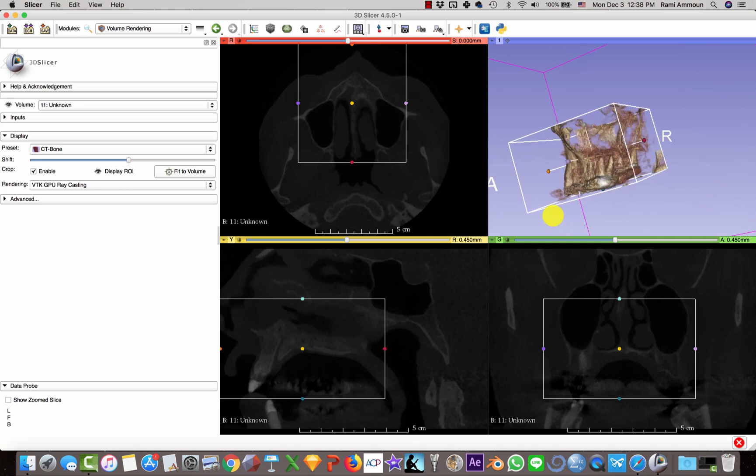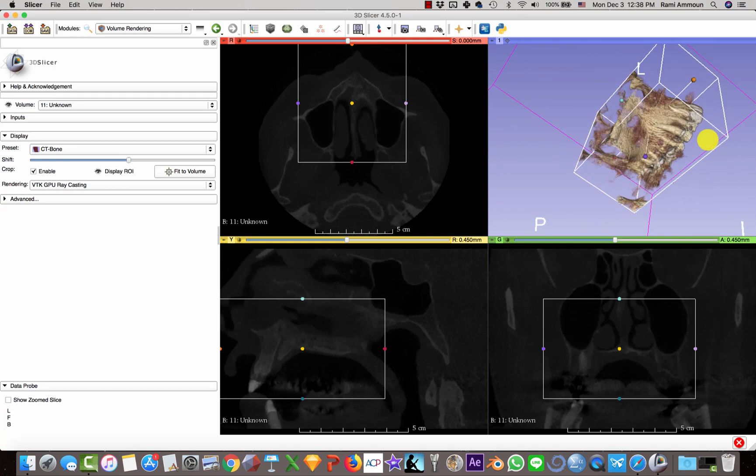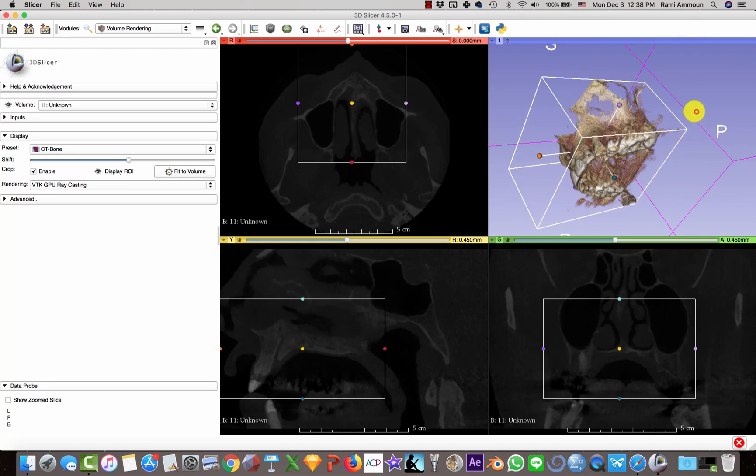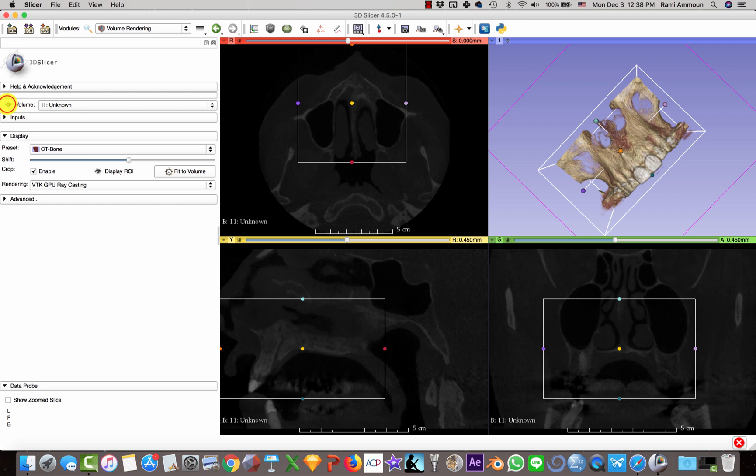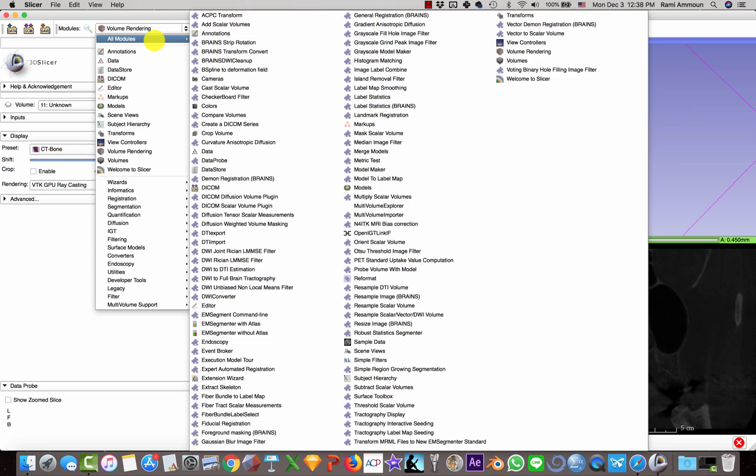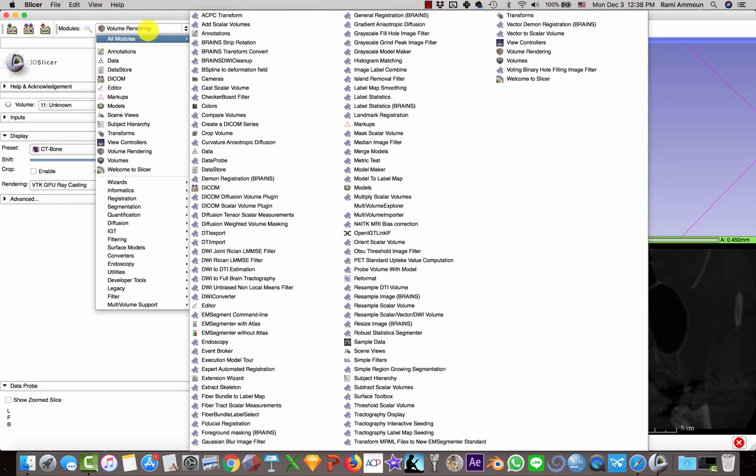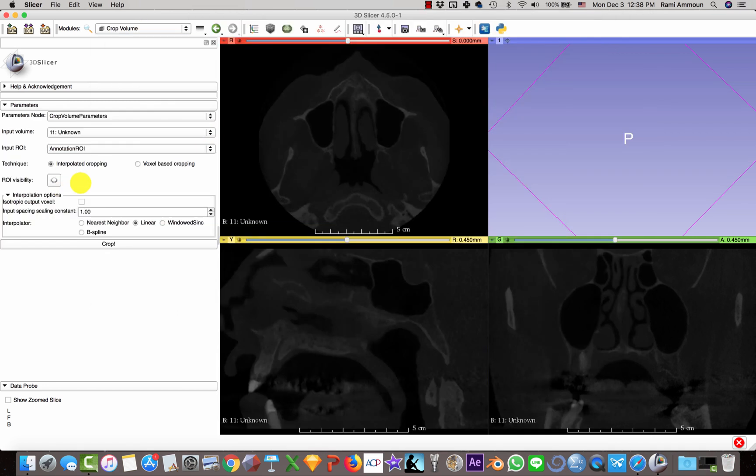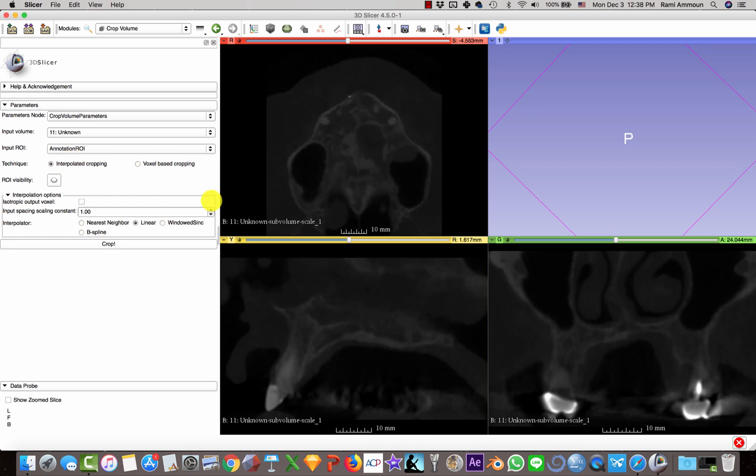So this is what I need. Then I'm going to hide everything I did. I'm going to go to All Modules, Crop Volume, then I'm going to select Crop, and this is going to crop my CT scan to the region of interest.